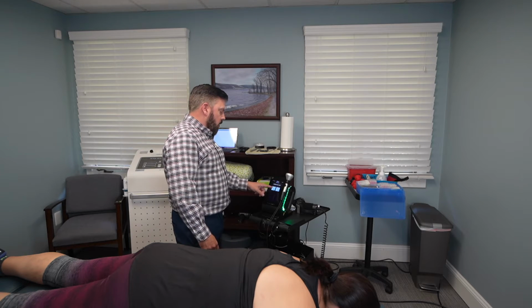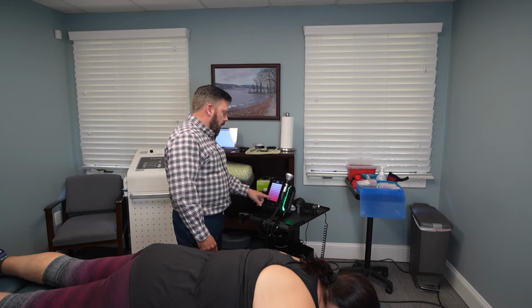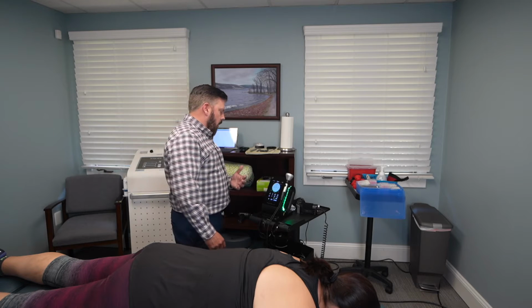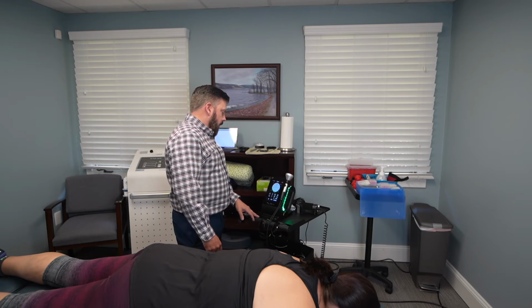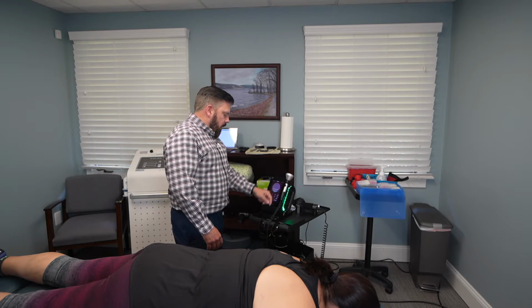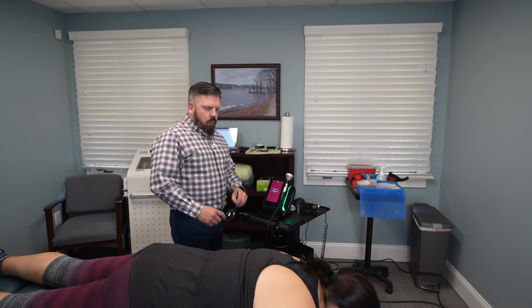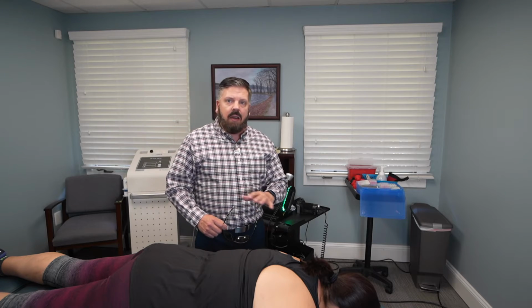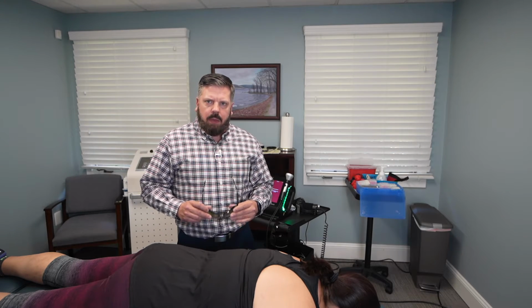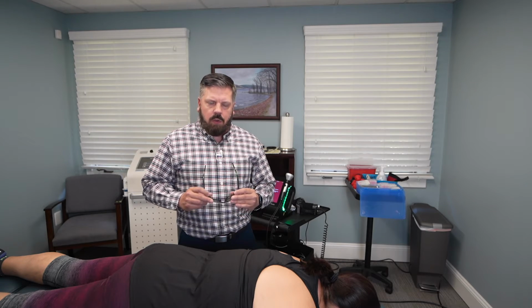Ideally, we see a patient as soon as you get the shingles because that will help get rid of it faster. So the treatment protocol takes about 5 minutes. It can be longer depending on the body part we're working on, but along the thoracic region, that's what it takes. So we're going to start the treatment. Now what the patient's going to feel like is just a mild warm sensation over the area. It does not hurt, actually feels really good if you're dealing with shingles. So when we're using laser therapy, the only thing we have to do is wear protective sunglasses over our eyes.